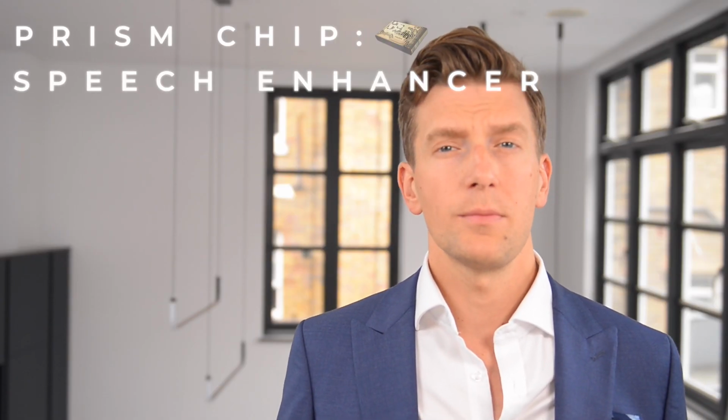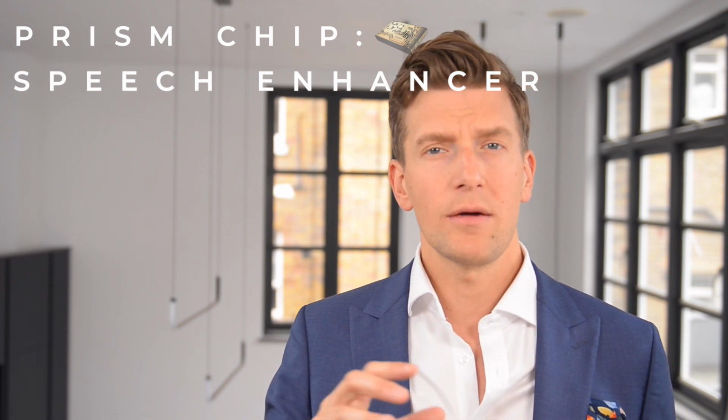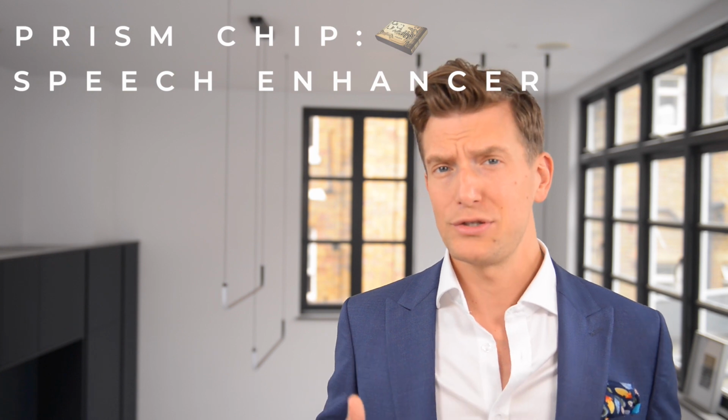The speech enhancer that Phonak have introduced into the Prism chip is essentially designed to reduce listening effort, and the whole theory behind it is that it gives you a little bit more amplification on the softer sounds so that it'll pick up slightly quieter speaking people, and at the same time people that are talking to you from a slightly further distance.